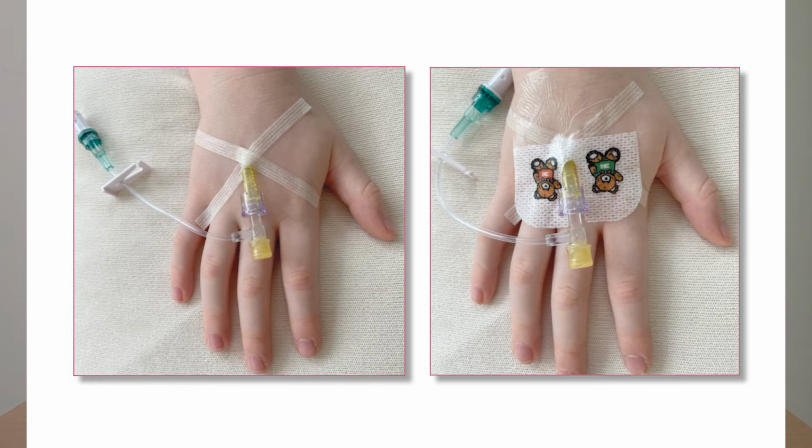Next, use some steri strips to initially tape down the cannula. These are longer than the actual strips you get with the cannula dressing. How you do this is personal preference, and you'll soon notice that everyone has their own little ways of doing this. Some people loop under the cannula, some people just go across, some stick down diagonally. However you do it, it doesn't matter as long as it's secure and the insertion site remains visible.